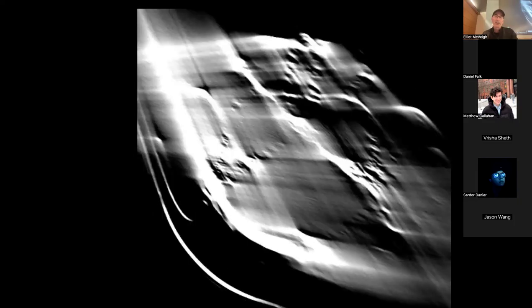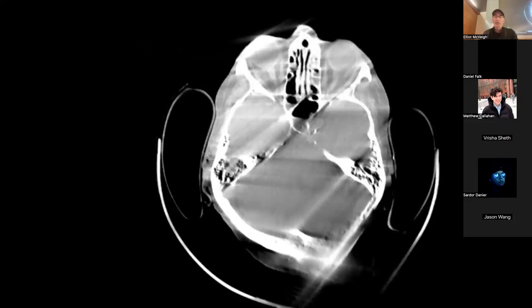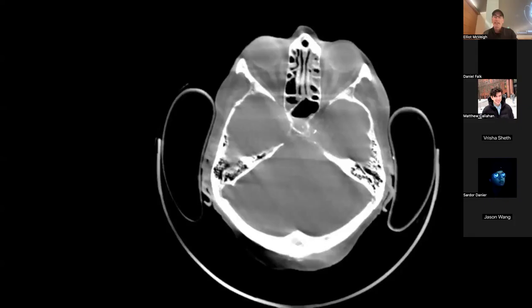As I go to 90 degrees here, now I've got views, I'm projecting views down this way in the sample, and I can tell you something about the edges in this direction, right? Because my projections are going down this way. I still have these edges over here. There are some directions, like this way, I don't have any edges yet. Then I rotate around more until finally I've gone to 180 here, and I've pretty well got all my edges figured out at this point, right, as to what's there.